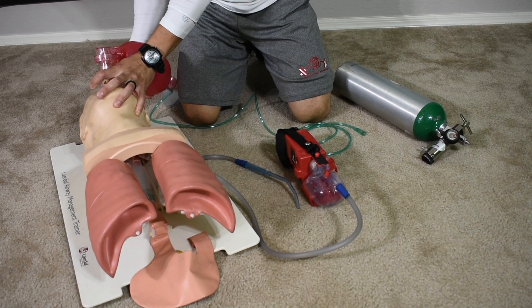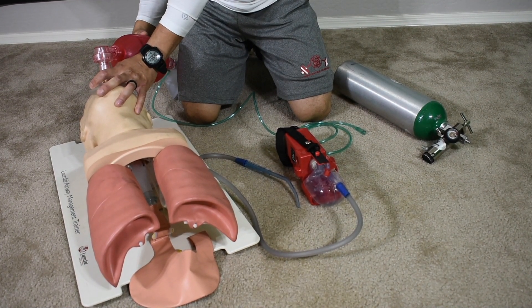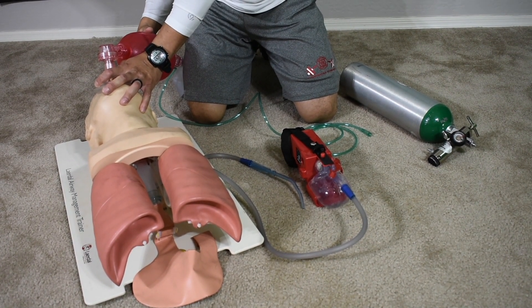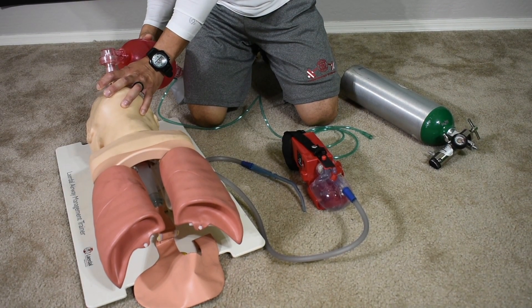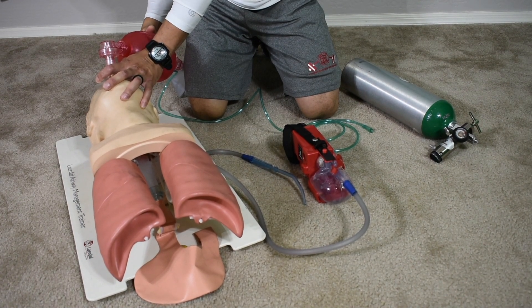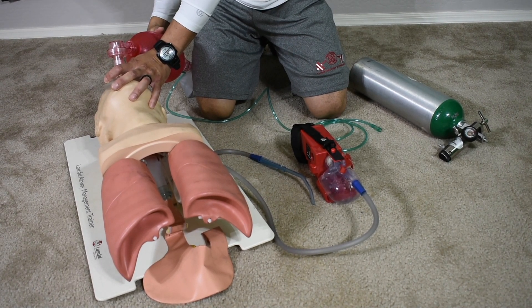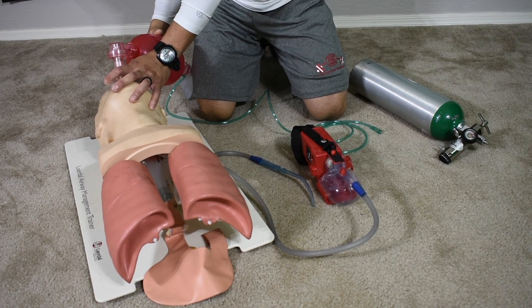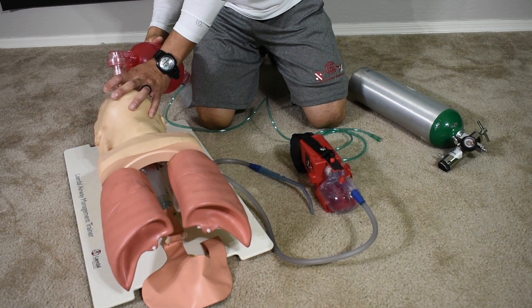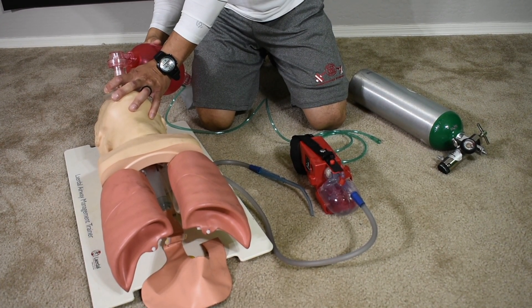Ventilating with BVM: one breath, then counting — 2, 3, 4, 5 — then another breath, repeating the cycle consistently at the target rate of 10 to 12 breaths per minute for the duration of the ventilation sequence.